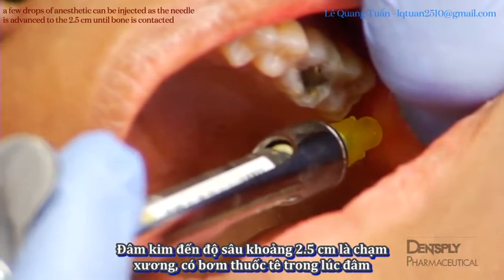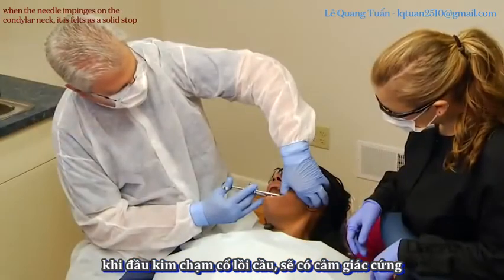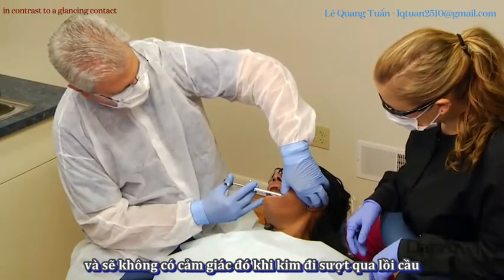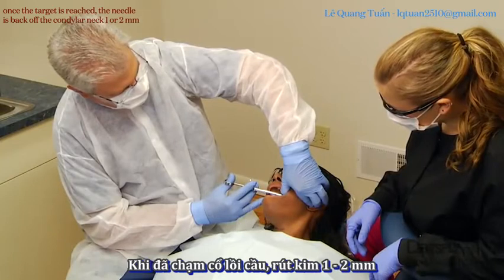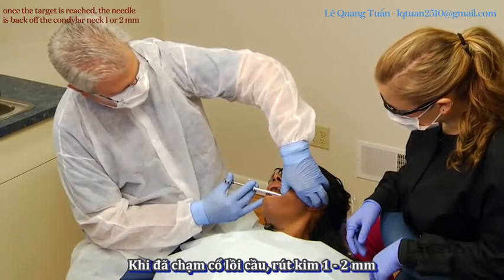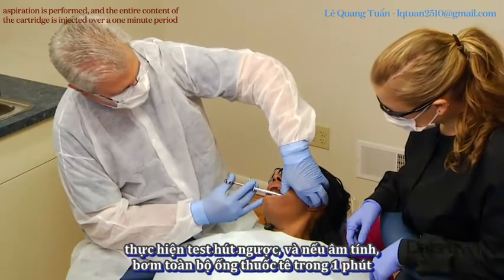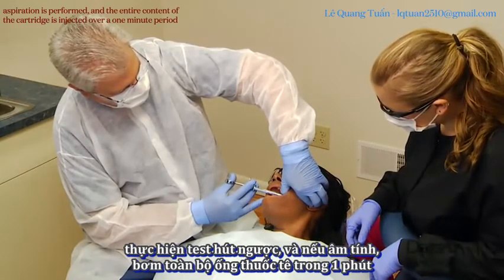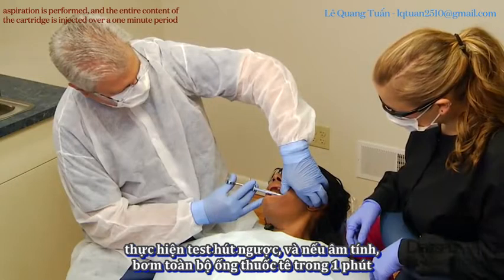A few drops of anesthetic can be injected as the needle is advanced to 2.5 centimeters until bone is contacted. When the needle impinges on the condylar neck, it is felt as a solid stop, in contrast to a glancing contact. Once the target is reached, the needle is backed off the condylar neck 1 or 2 millimeters, aspiration is performed, and the entire content of the cartridge is injected over a 1-minute period.